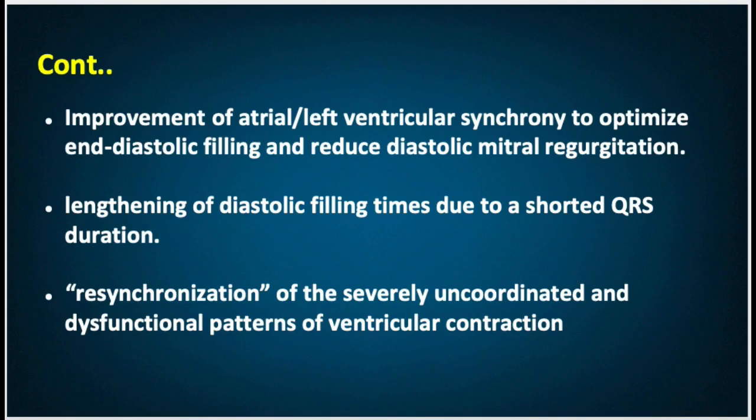The third and probably most important factor is resynchronization of severely uncoordinated and dysfunctional pattern of ventricular contraction in patients with prolonged native QRS complex. Biventricular pacing avoids the detrimental effect of right ventricular pacing alone.